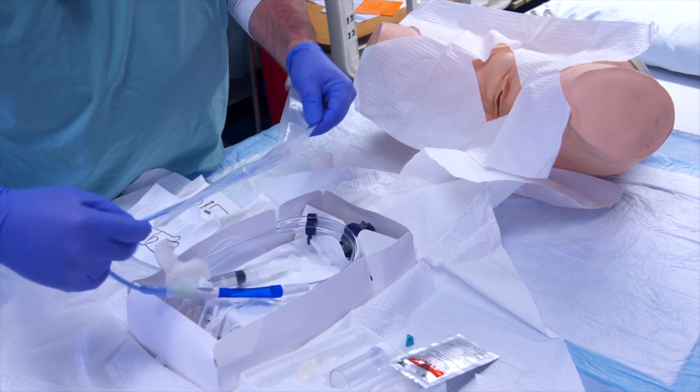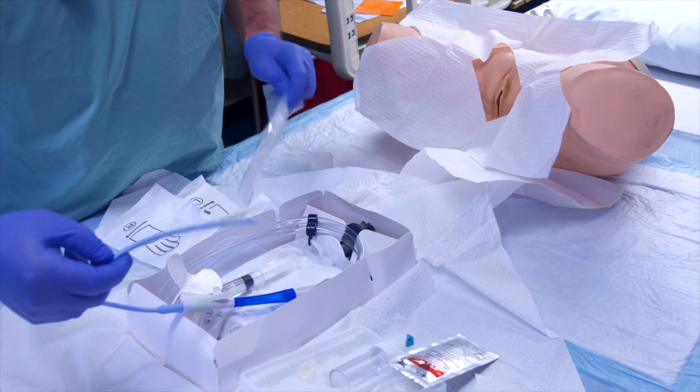With your sterile dominant hand, grasp the catheter and remove it from the tray. With your non-dominant hand, remove the dust cover off the catheter, making sure to keep the catheter over the sterile field. You may wish to coil the catheter for better control.